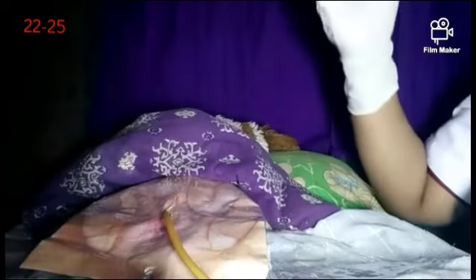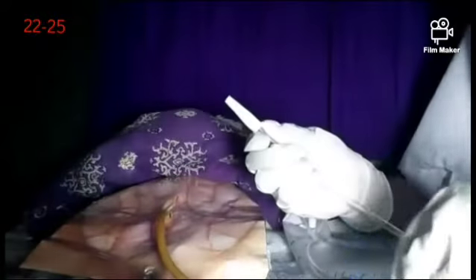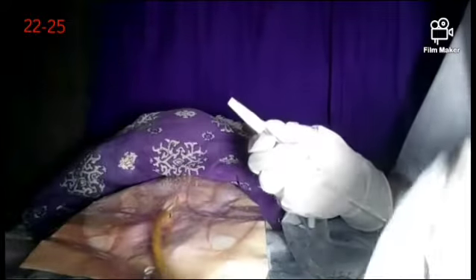Remove the fenestrated drape and discard, and attach the catheter to the urine bag below the level of the bladder, and remove the cap of the urine bag.